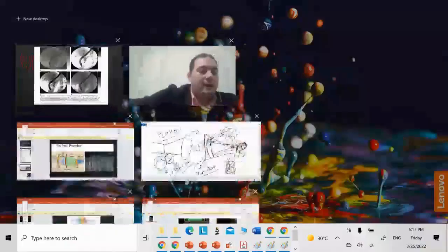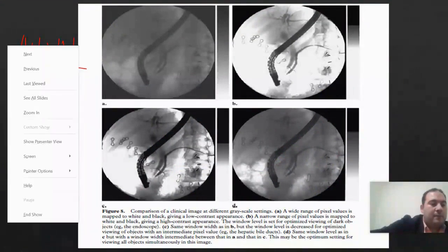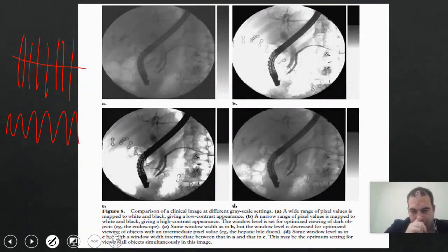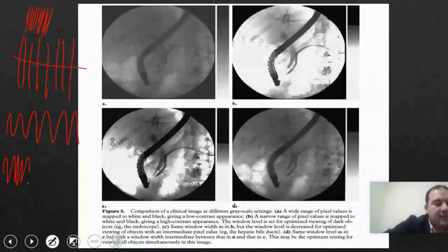When we say that if you take a line profile like this, it will start to appear in this way. Okay? If I increase the number of line pairs significantly in a small distance, then the frequency of the wave will increase.